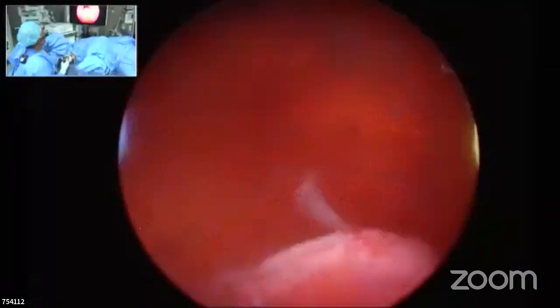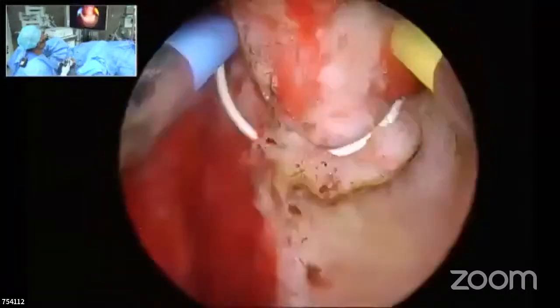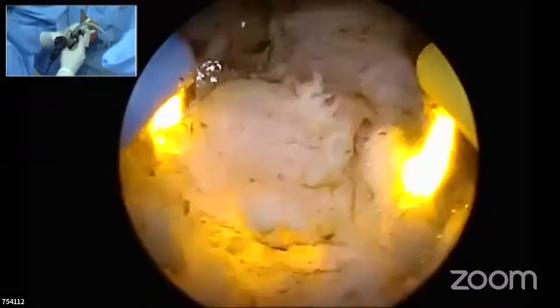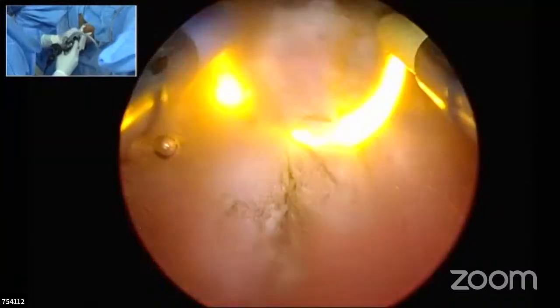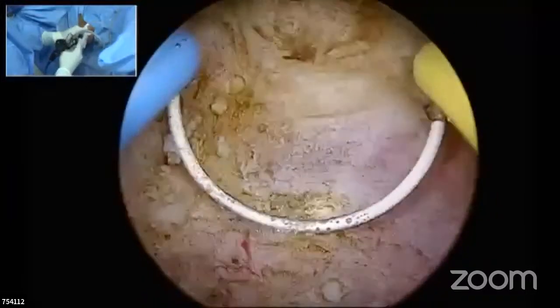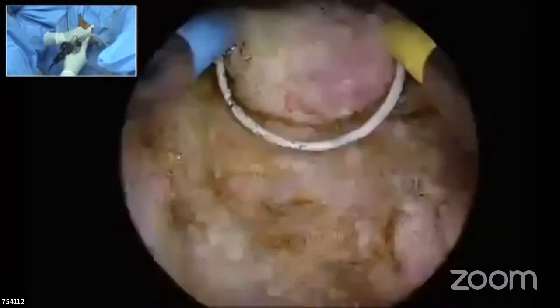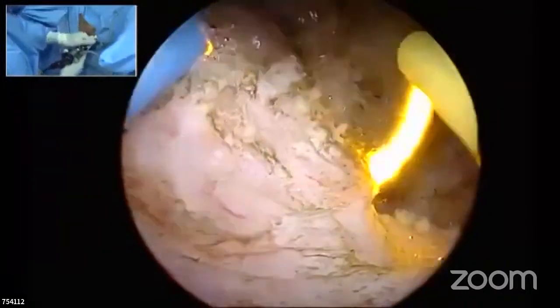So this is continuous versus intermittent. I feel, see, if you're doing continuous, your pressures are always low and you get the tissue to resect easily. Because when you are doing intermittent, the pressure builds, the tissue collapses and moves away. Then you empty it, and you find more tissue coming inside. I don't deny that. That's exactly what I'm saying. But if I have a gland of 60 or 80 grams, I'll definitely do it with continuous only. Here I'm taking a little more time for demonstration. Majority of the time, routinely, I would have used continuous today probably. But anyway, that has been my routine, so I just adopted the same.